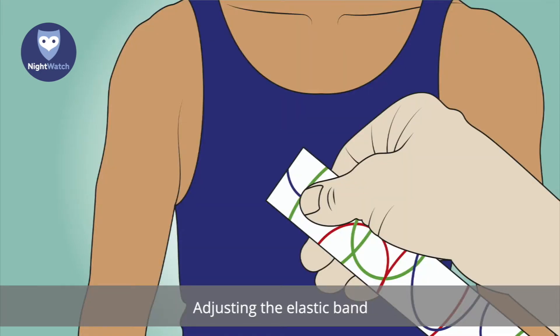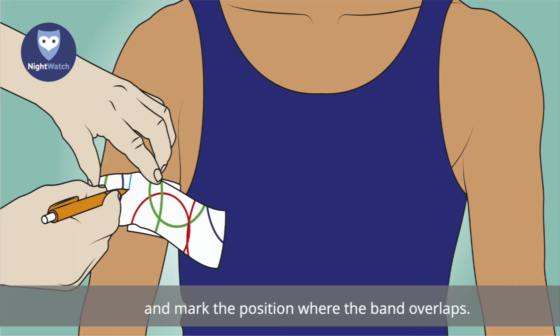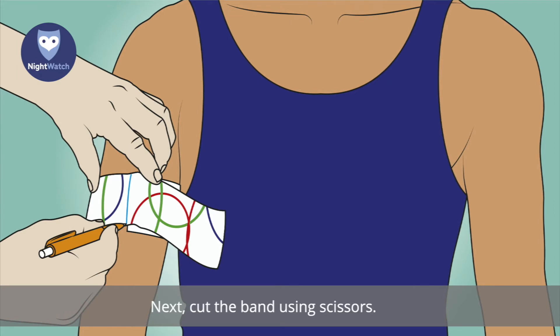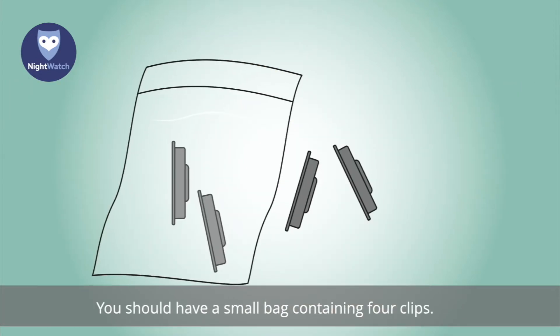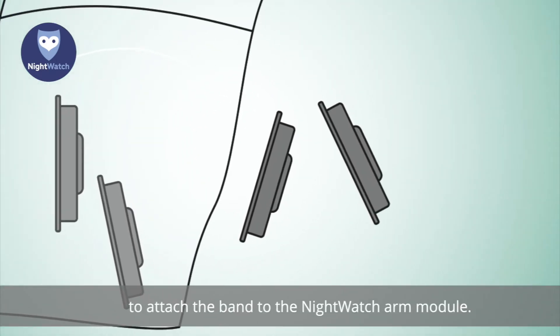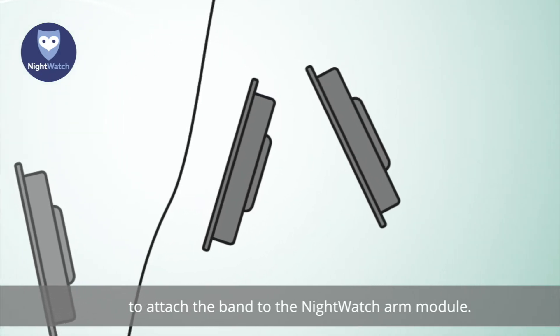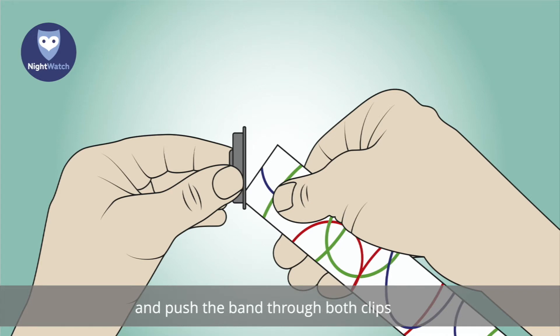To adjust the elastic band, first cut the elastic band to size. Place the band around the wearer's upper arm biceps and mark the position where the band overlaps. Next, cut the band using scissors. You should have a small bag containing four clips. Two of these clips are needed to attach the band to the Nightwatch arm module.